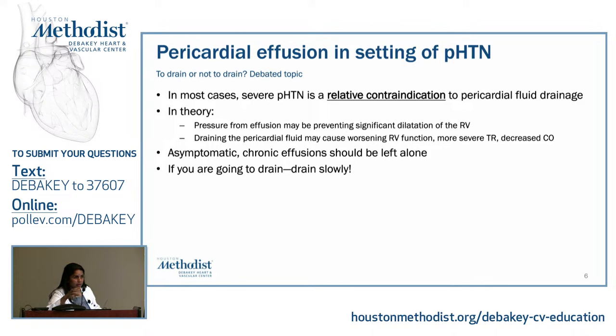Dr. Pasha was about to say. I had 2 patients with LV diastolic collapse, both PH patients, and both got the drainage of the pericardial fluid. So their LV filling pressures could be low. Their intrapericardial pressure might exceed that LV EDP. But you saw how the LV is very small and hyperdynamic. Part of it is also all the vasodilators that they're taking will cause their blood pressure to be low. Their LV EDP is low. But it doesn't carry an ominous sign as historically RV diastolic collapse does. Yeah, so important points, right?